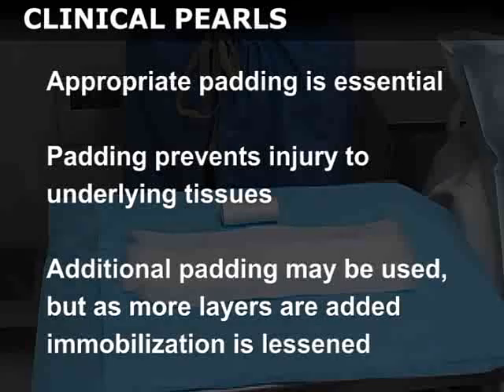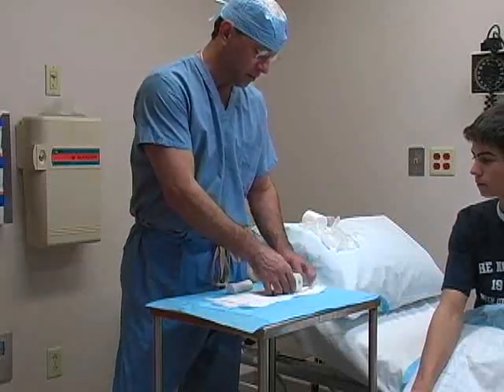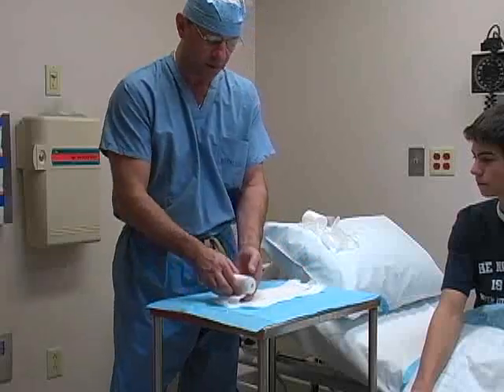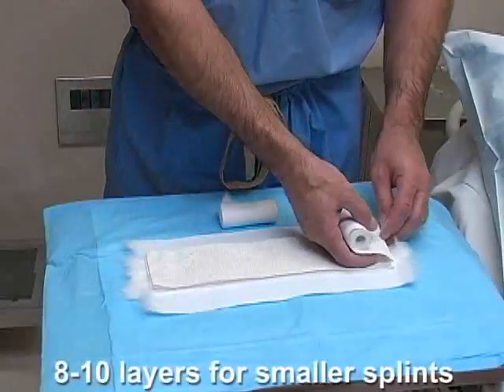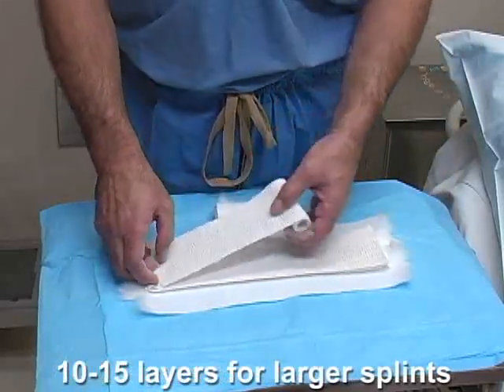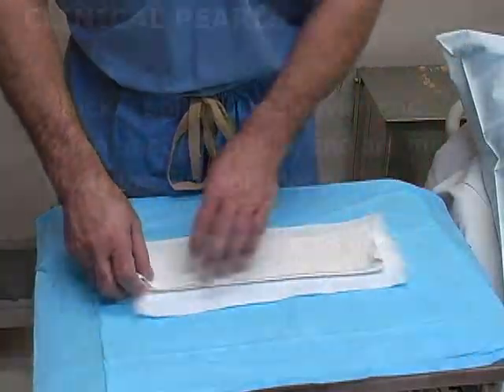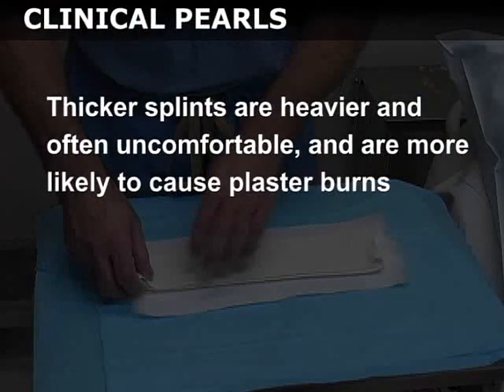Additional padding may be used if desired. However, as more layers are added, the immobilization offered by the plaster is lessened. Next, roll out layers of plaster bandages over the cast padding. For smaller splints, usually 8–10 layers of plaster are used. For larger splints, 10–15 layers may be required. Be aware that thicker splints are heavier and often uncomfortable for the patient, and are more likely to cause plaster burns.